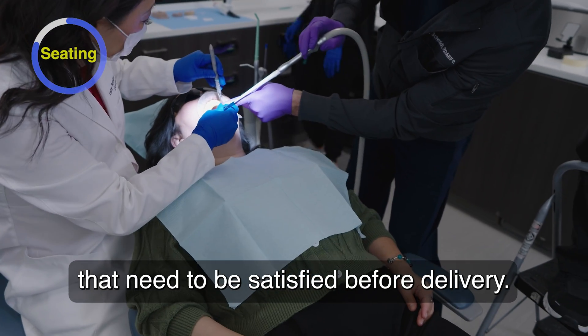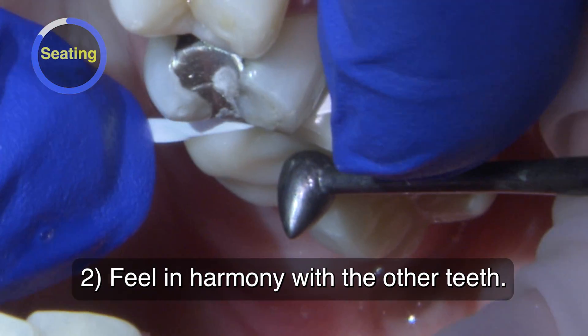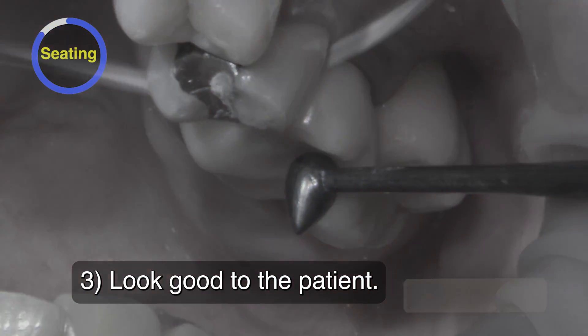There are three requirements that need to be satisfied before delivery: the crown needs to fit well to the margin, feel in harmony with the other teeth, and look good to the patient.